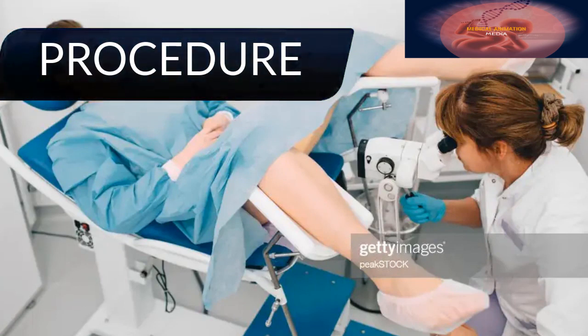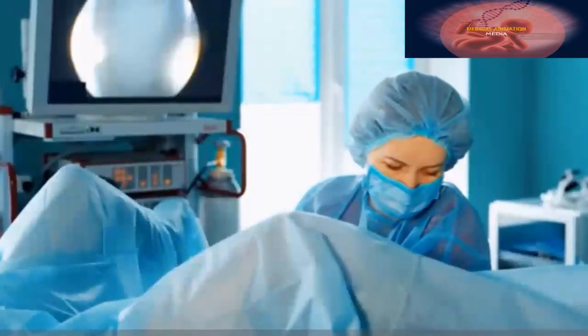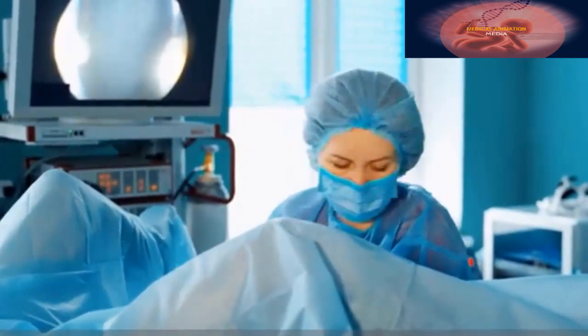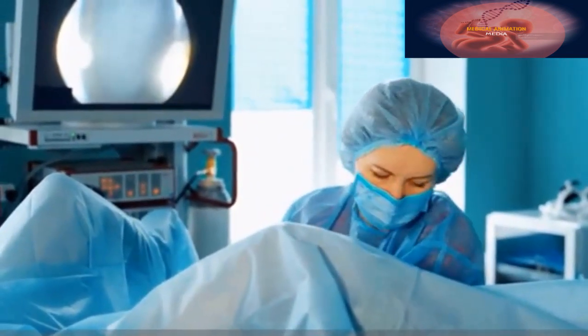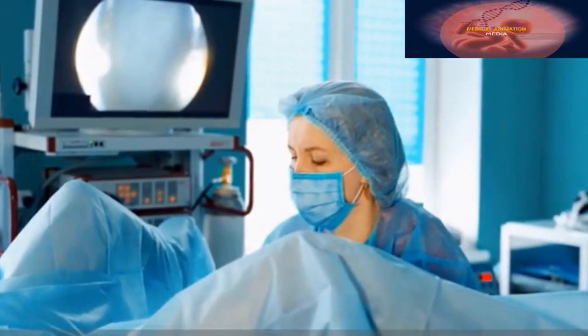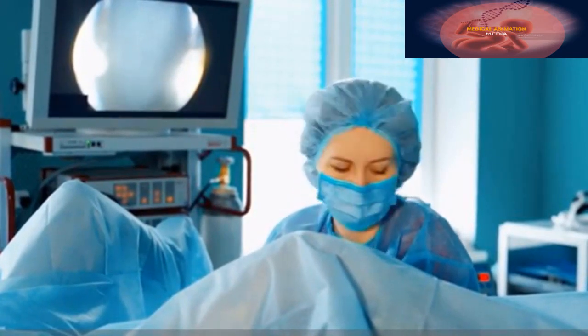This procedure, which takes about 10 to 15 minutes to perform, is a visual examination of the cervix with a microscopic viewing device called a colposcope. It may be performed in conjunction with a biopsy or other procedure.